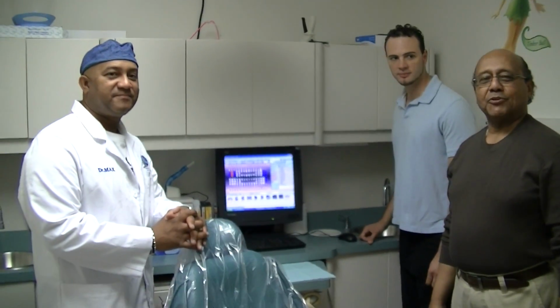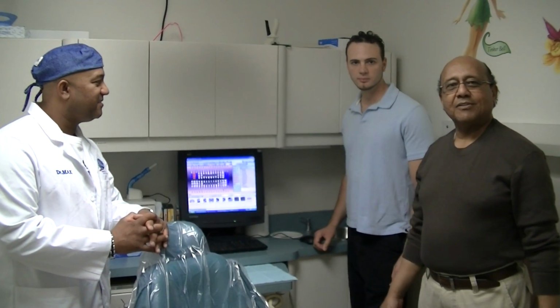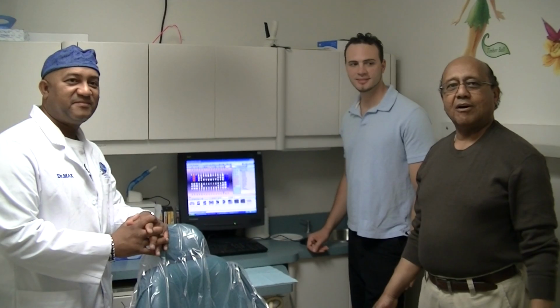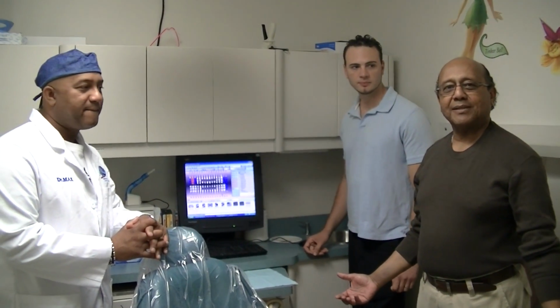Okay, we're here in an operatory now, and Harry has joined us. Harry is a clinical supervisor here and works with Dr. Max very closely, and they're going to give us now an overview of what goes on in an operatory and how the software impacts upon that.